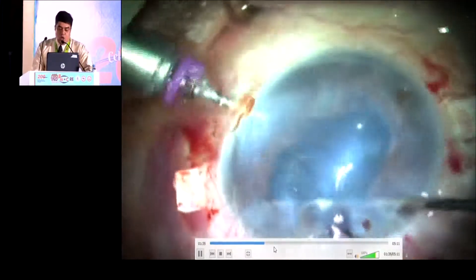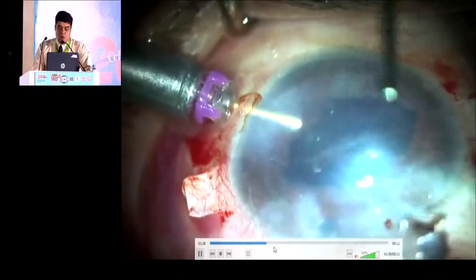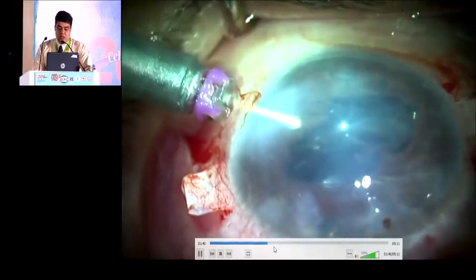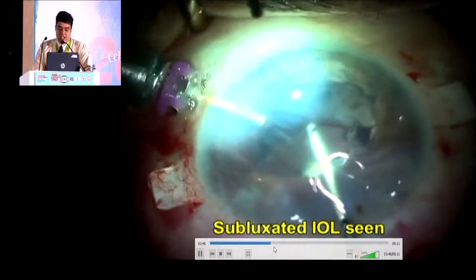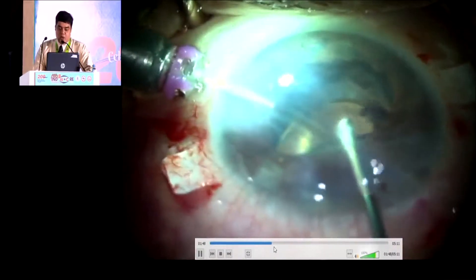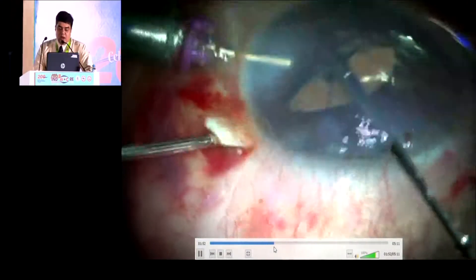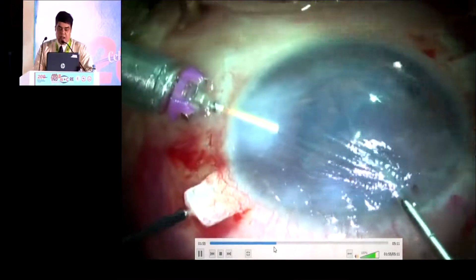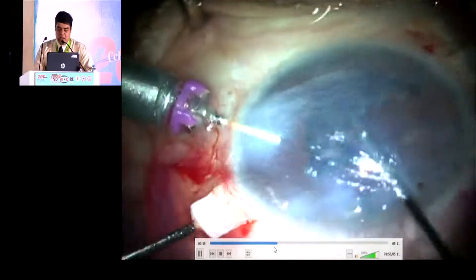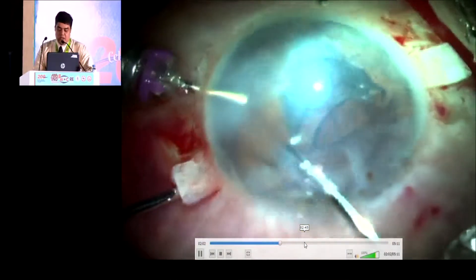Now, once this is removed, the next step, we want to see the intraocular lens. As you see, it is subluxated there. By the handshake technique, we are trying to hold the haptic from the main incision and trying to hold the tip of the haptic and trying to externalize it. As a lack of time, I am going to skip the glue IOL technique in this.